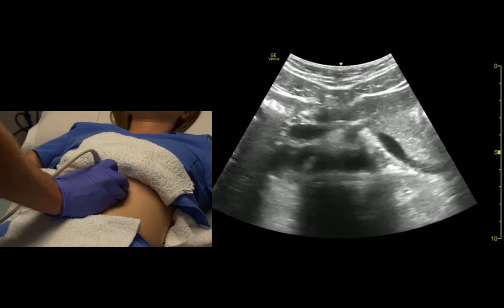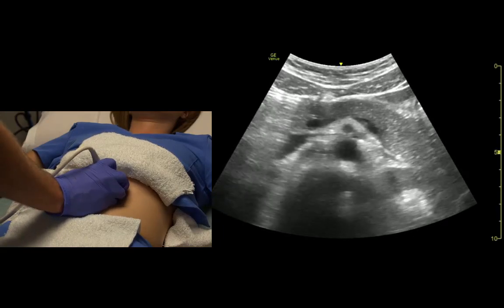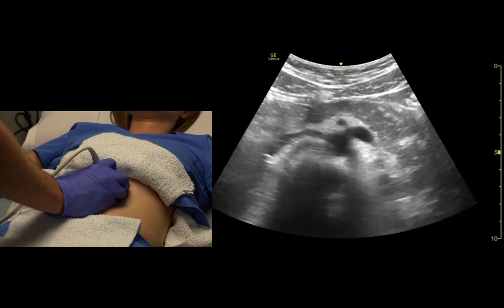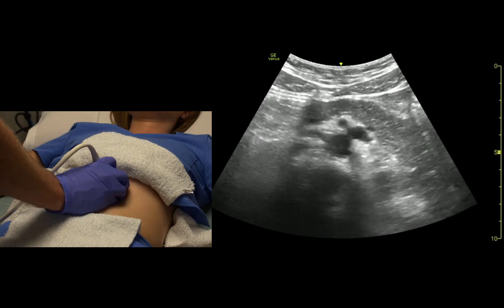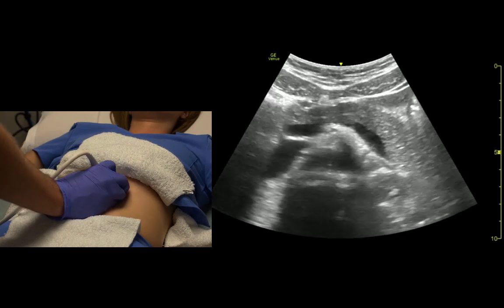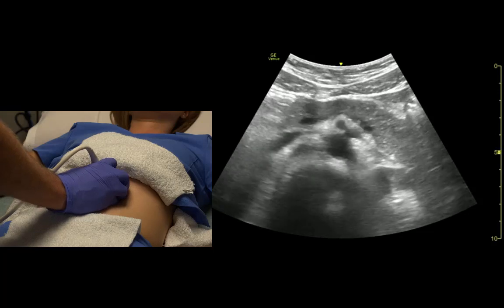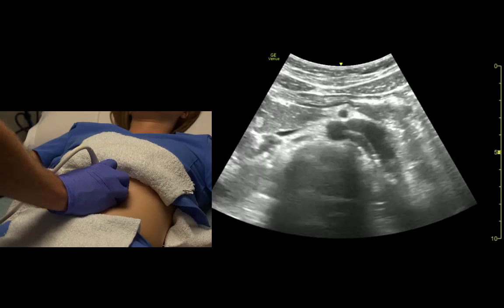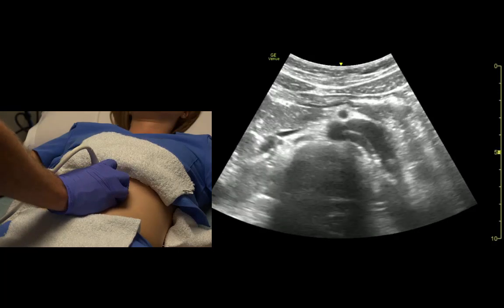And if we're really good, we can sometimes see the renal arteries. There's the right renal artery, and there's the left renal artery cutting down.